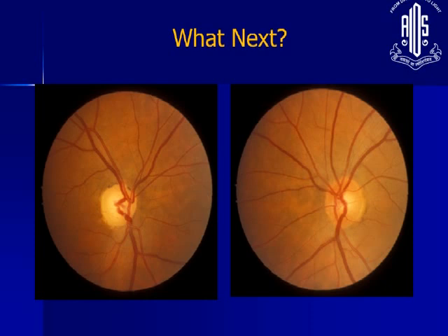So anybody knows what are the other uses of OCT in neuro-ophthalmology? Where else would you use OCT in your neuro-ophthalmic assessment of a patient? Any ideas? OCT has also been used. Suppose patient has pituitary adenoma. What kind of visual field defect he'll have?